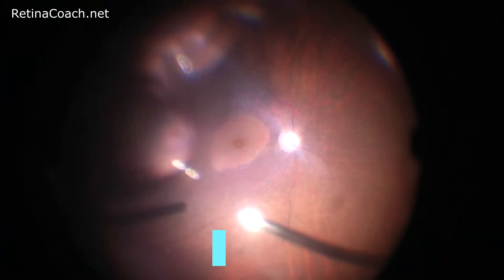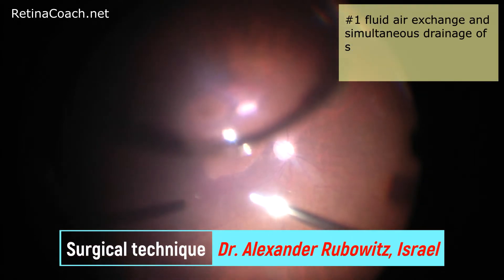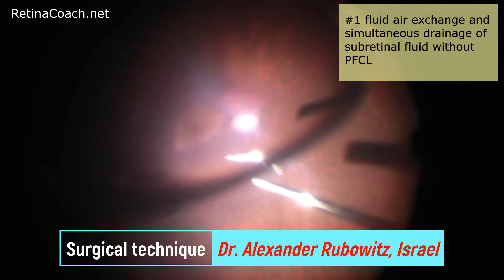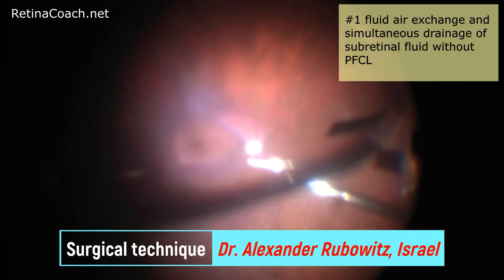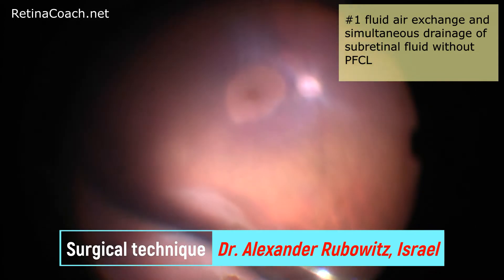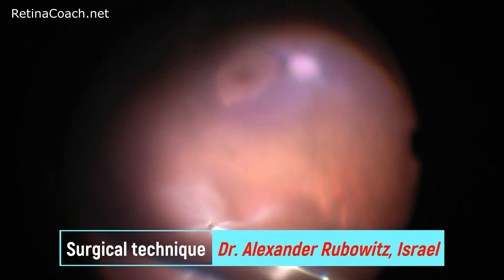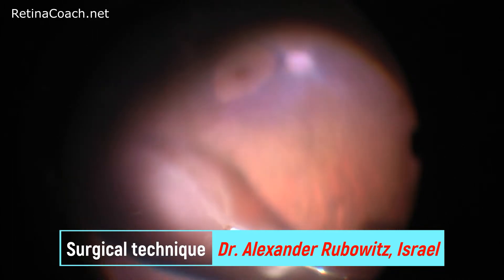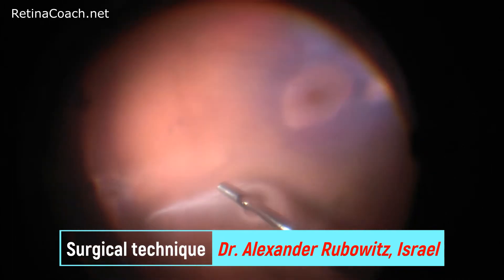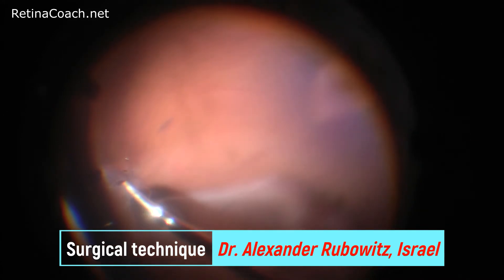The first technique is fluid-air exchange and simultaneous drainage of subretinal fluid through the retinal break without perfluorocarbon placement. This technique is suitable for peripheral retinal detachment where a relatively small amount of subretinal fluid is present. The fluid needle is kept over the break and subretinal fluid is continuously removed as the eye fills with air.